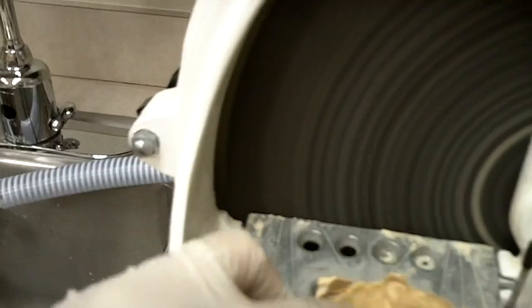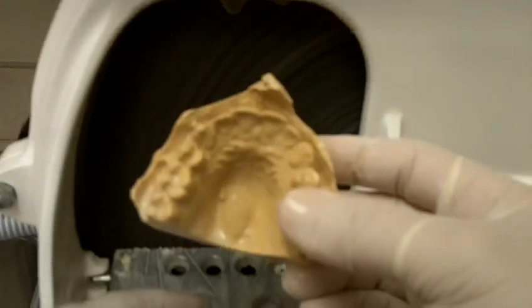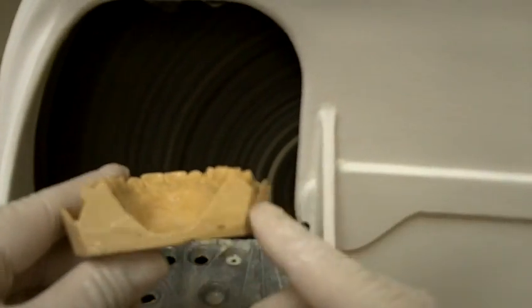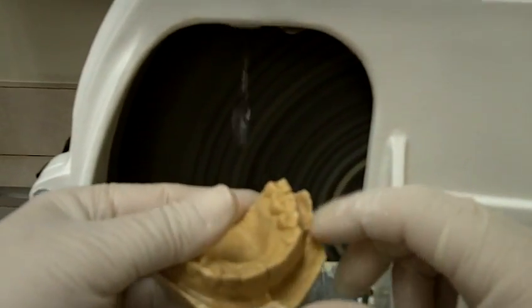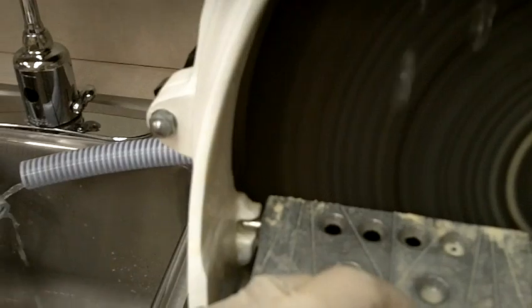Okay? Once I do that, the last thing I'm going to do is the heel. And the heel. Don't worry about all this other stuff here, because what you're going to do is you'll rinse it off. Here are my heels. And I'll show you what you'll do with a knife afterwards. You'll get a knife and you'll trim this down and make it look pretty, and I'll show you how to do that.